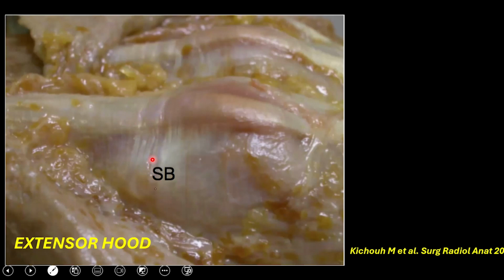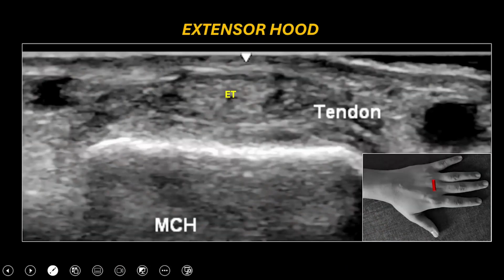You can see that this is the sagittal band extending from the volar aspect of the metacarpophalangeal joint, from the volar plate, and it acts like a sling. It acts as a sling and keeps the extensor tendon on the dorsal aspect of the head of the metacarpal.